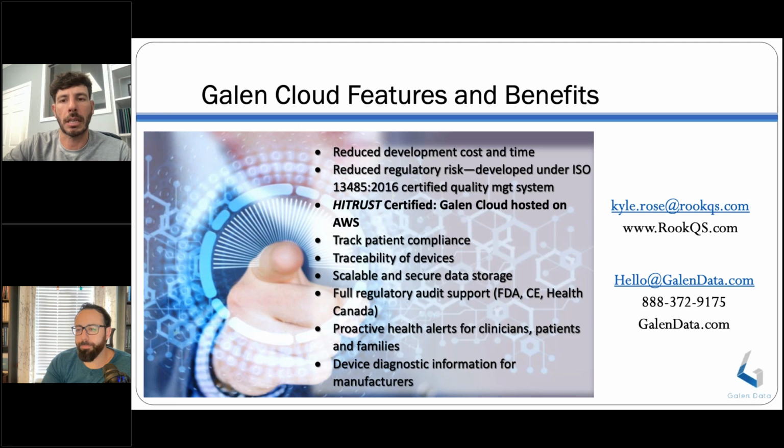of materials is moving towards having an accurate and up-to-date list of all the different aspects of your software and different tools, libraries, or software features and the version of those that are supported on your software, and having that in one easy to access list. Another key aspect of that is when you go and update software, making sure you look back at these other aspects of your software BOM to make sure they are updated and incorporated in your testing as well.